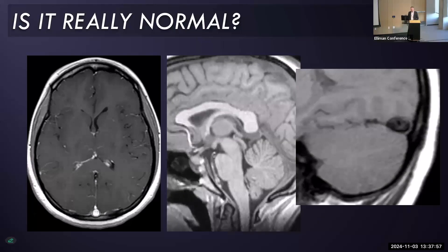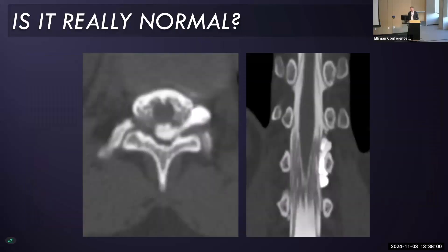So while this patient was initially thought to have negative brain imaging, I would say this is definitely positive. This was the patient's CT myelogram, and you can see one of these lateral dural tears that's partially contained. It turns out that patients with contained epidural leaks — whether ventral or lateral — have a much higher rate of having negative brain imaging.